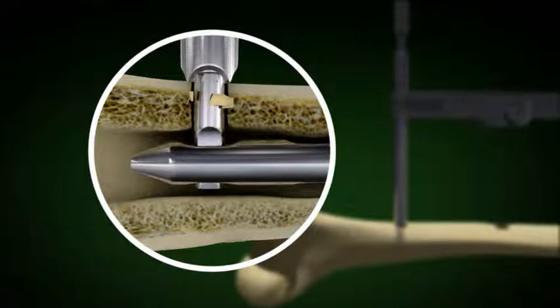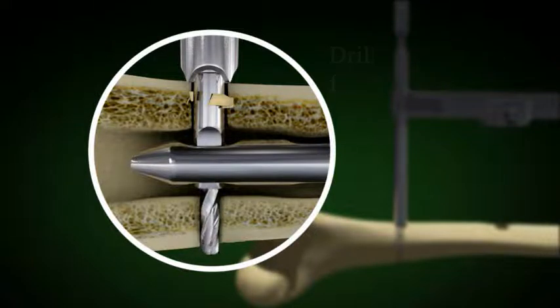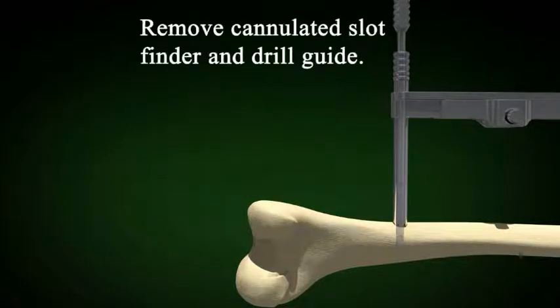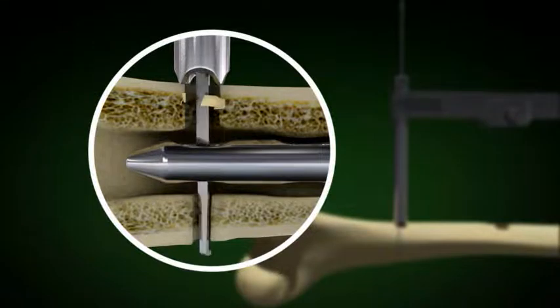Once the cannulated slot finder is inserted, drill the hole in the far cortex. Remove the drill bit and replace it with the depth gauge. The depth gauge is used to mark the hole. Remove the cannulated slot finder and the small drill guide to accurately measure for the screw. Measure on 2 sides of the hole.